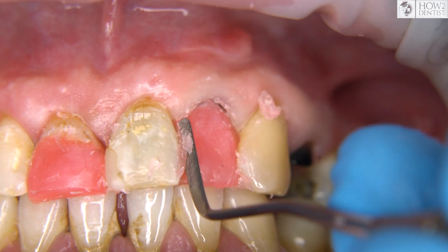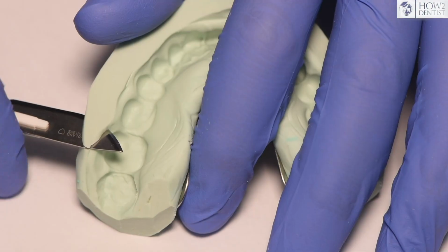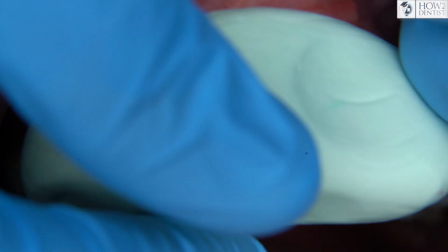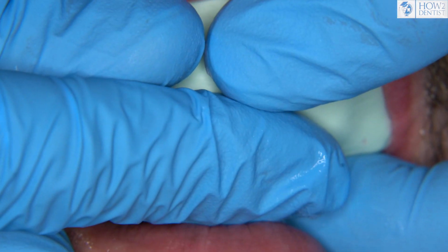We make the final anatomy while the wax is fixed to the near teeth enough to make and get a silicone key. We shared the features of processing silicone key in previous videos. In this case, we got a template with C-silicone without a tray, as it's quite tough. It's better to use a tray if you work with A-silicone because it's softer. Working with C-silicone in a small area, we can work without additional tools for making a silicone key and simply compress the segment we are interested in with silicone.